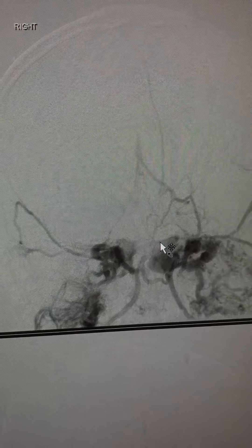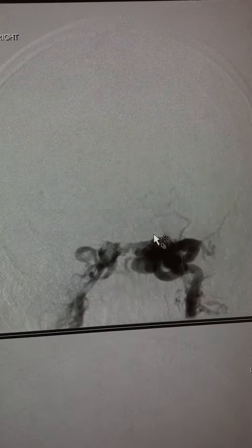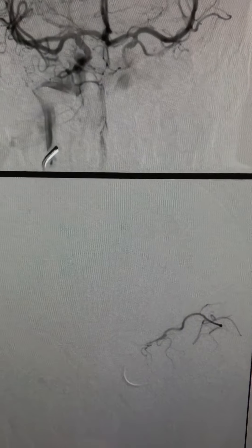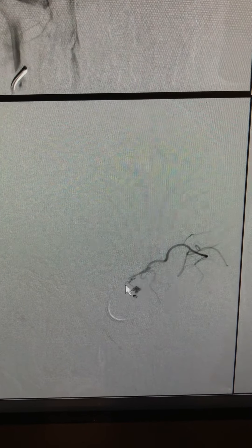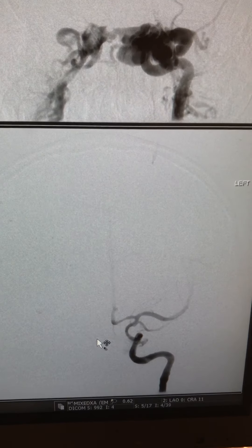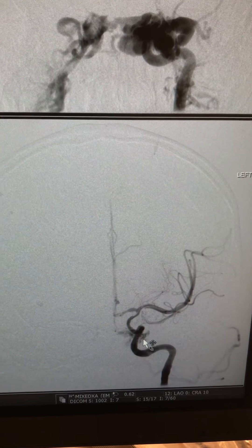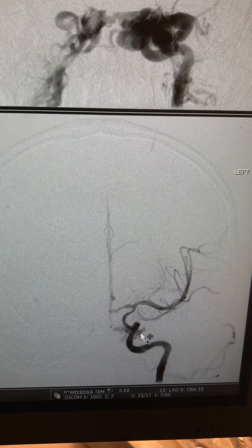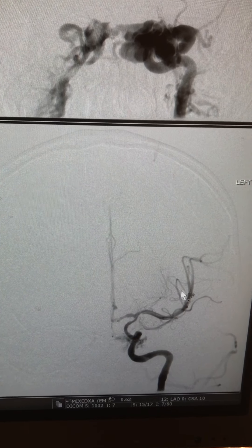The way we treat this: we cross through the normal artery from the normal side, bypassing the site of all these communications — whether one or multiple; in this case there were multiple. We make sure we are in the right place — this is the microcatheter crossing — and we inject distal to confirm we are inside the branches of the middle cerebral artery. Then we place flow diverters. As you can see, there is almost immediate stagnation of flow going into the communication, and most of the flow now goes to the brain.